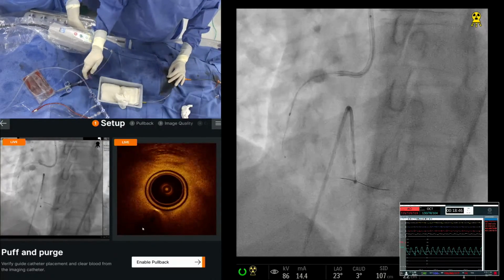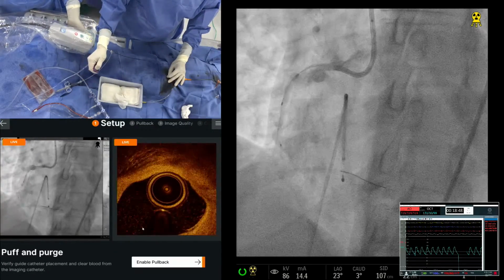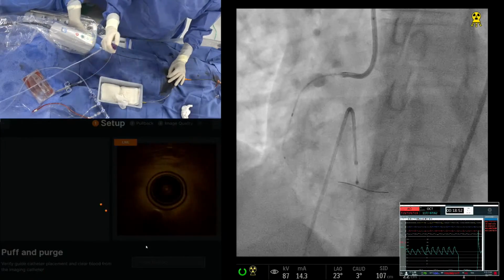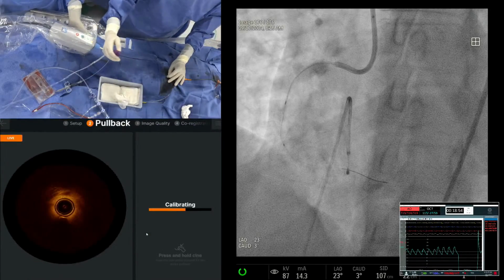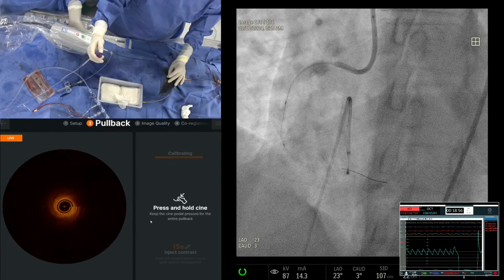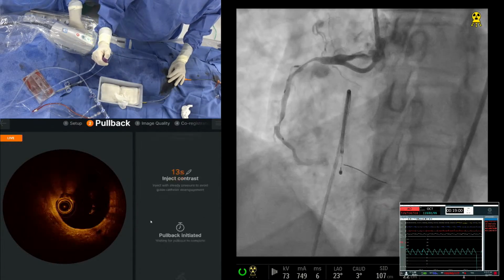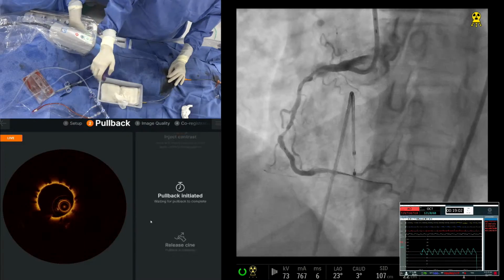So I think you have done still part of it, no? What's the reason you think India is such an outlier with the use of OCT? I think it's probably just the teaching. Please see the index. Yeah, beautiful image. You can take it out.